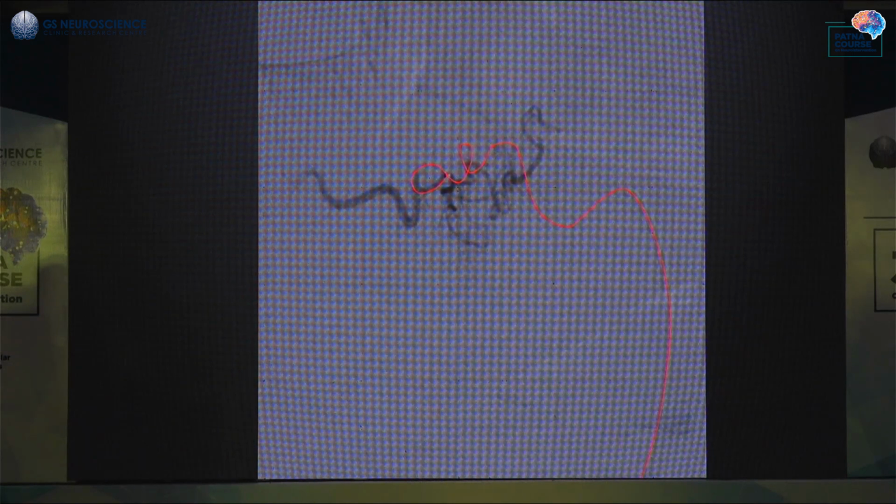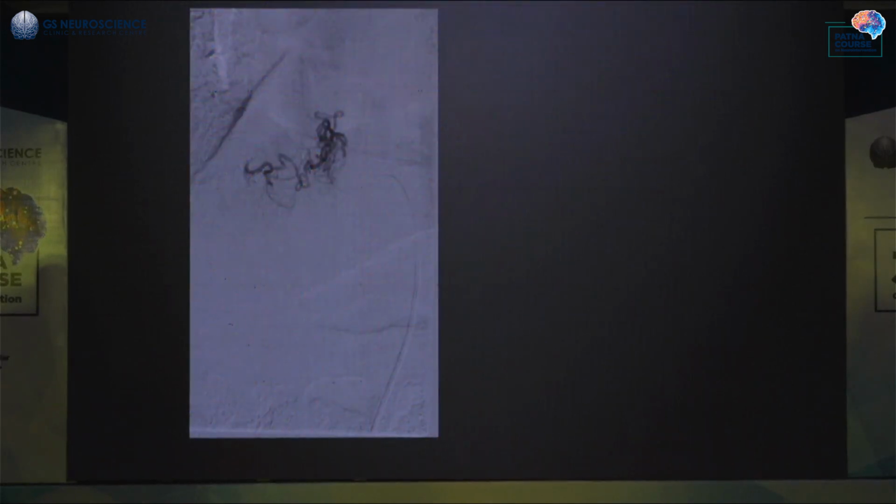So here, this is my initial microcatheter position. I'm going to push it further. This segment of catheterization is extremely difficult, because the more distally you push, your guiding catheter is going to kick back. You lose your current position. So you have to be extremely careful, always watch your guiding catheter and make sure that you're able to balance between the two as you push it forward.